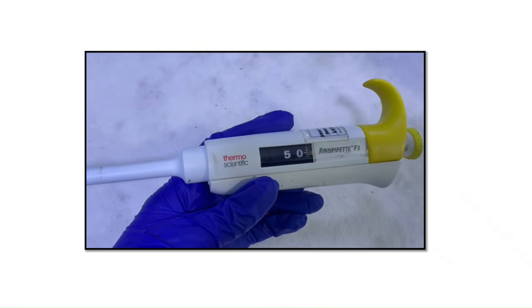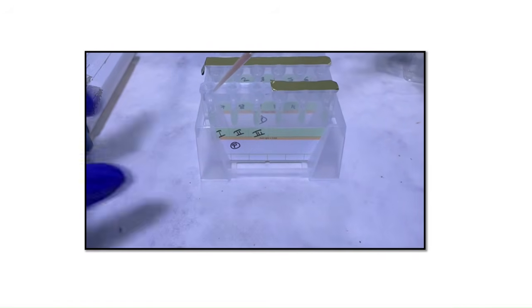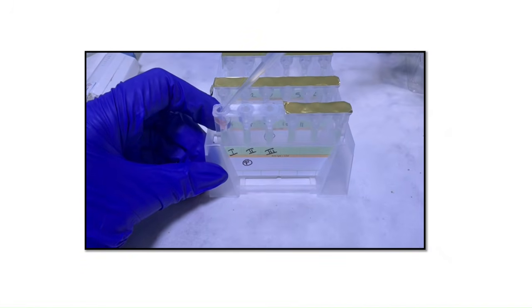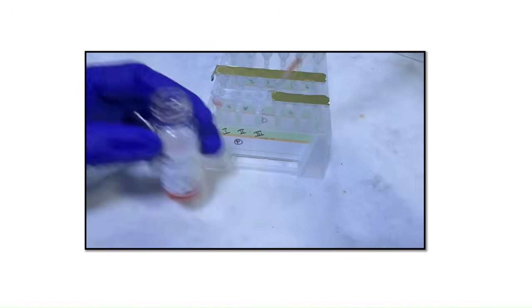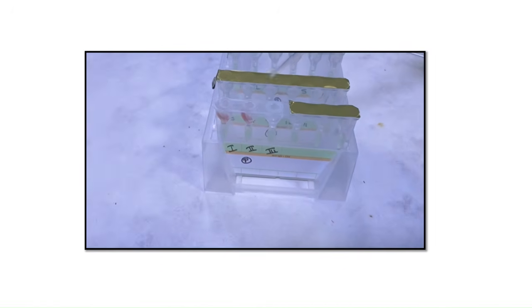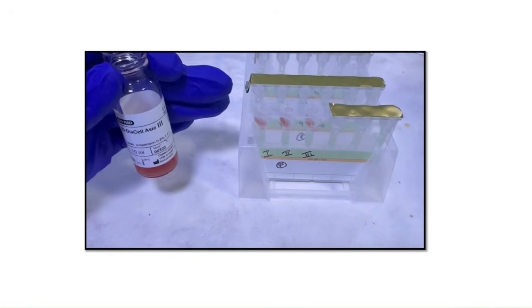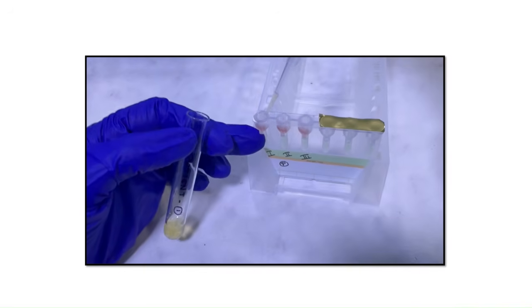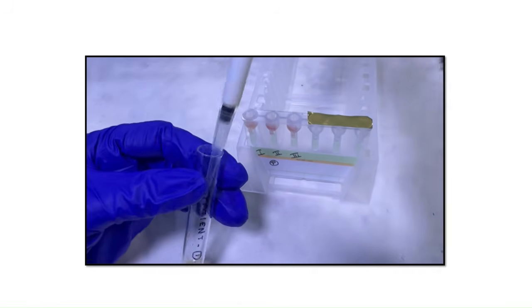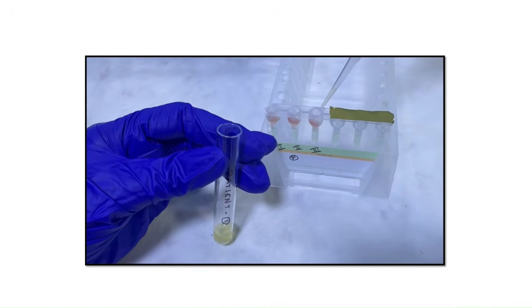For antibody screening using the commercially prepared reagent cells, we have to follow the manufacturer's instructions. For using the Bio-Rad cells, we have to add 50 microliter of the red cell to the AG card. So we are using the Bio-Rad's AG card. Here we can see we have added cell 1 and cell 2, and now cell 3. Next step is the addition of 25 microliter of patient serum to all the wells. Here we can see we are adding 25 microliter to cell 1, cell 2 and cell 3.